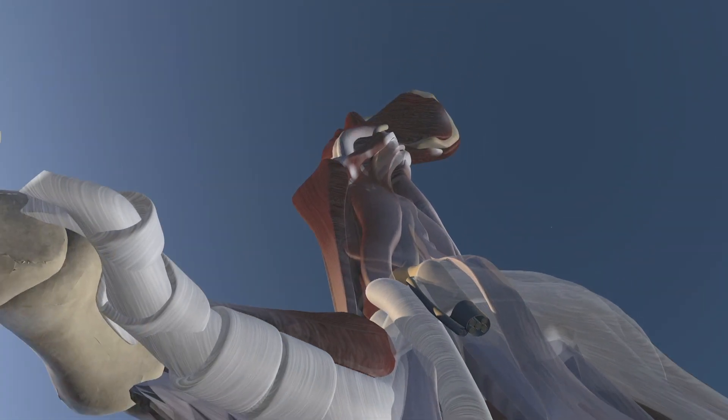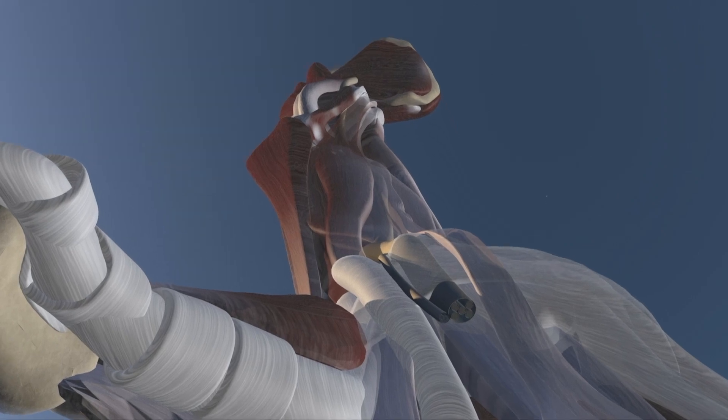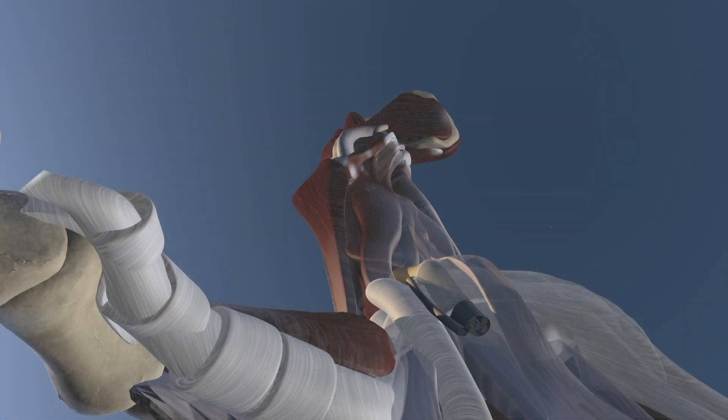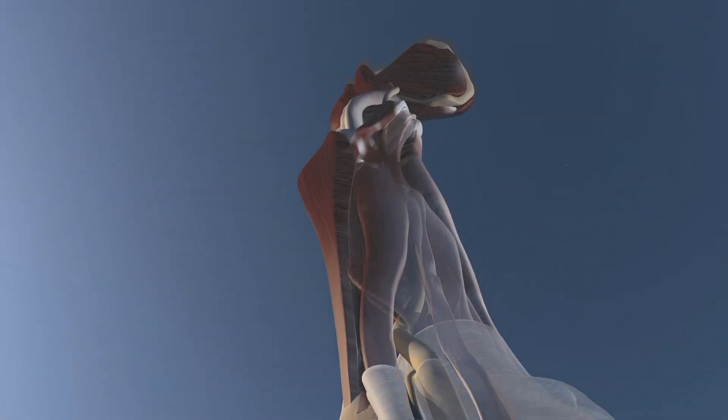Here we're going to focus on some of those nerve fascicles and bundles that are within each nerve. We're zooming in on a cross-section view of the median nerve, and you can appreciate how there are separate bundles within the nerve. That is important for identifying the nerve on ultrasound.